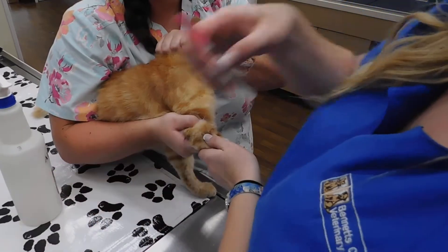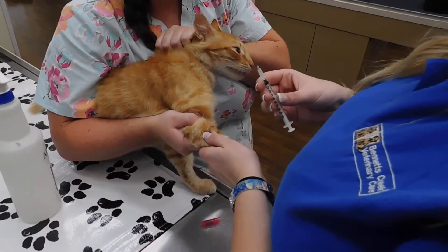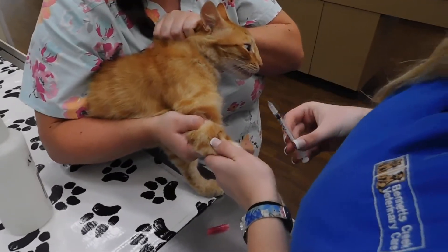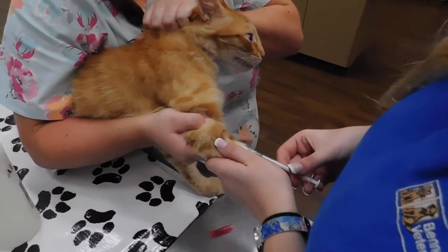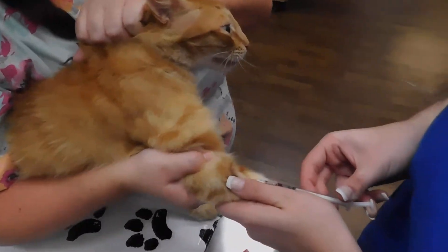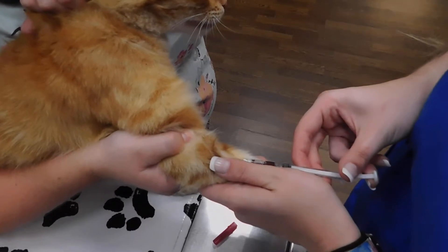We're going to uncap the needle, then we want to place the needle in there with the bevel up. I have my flash there, and I'm just going to gently pull back the syringe without collapsing the vein.